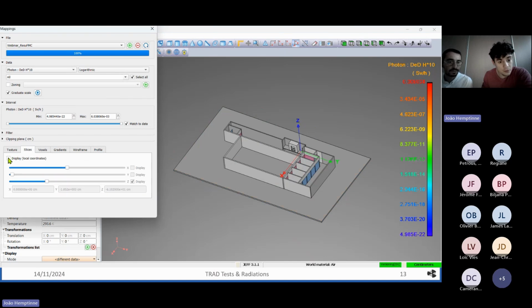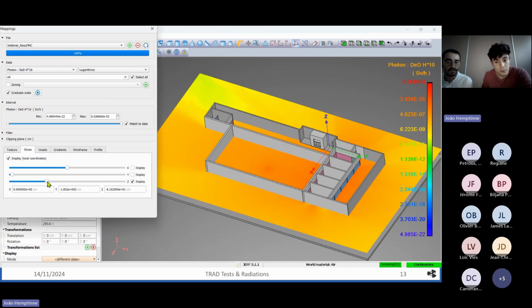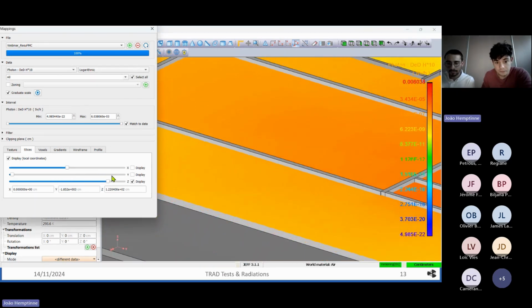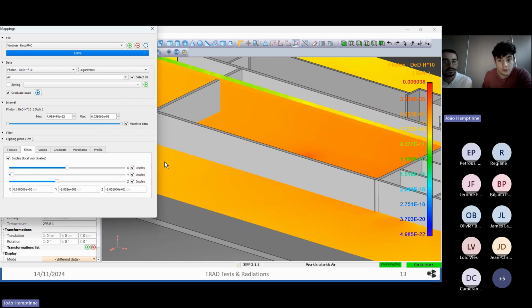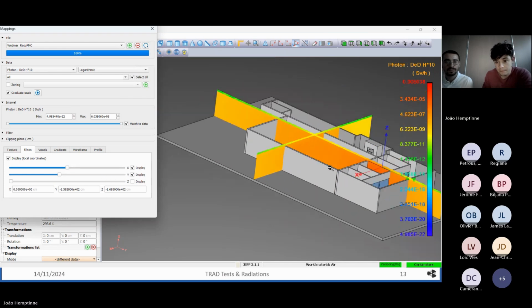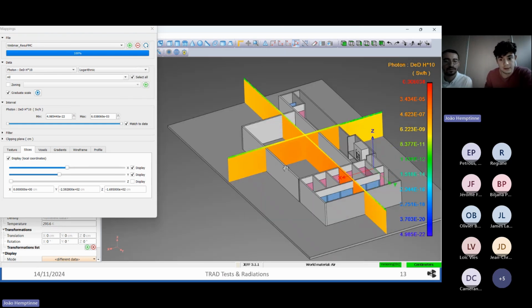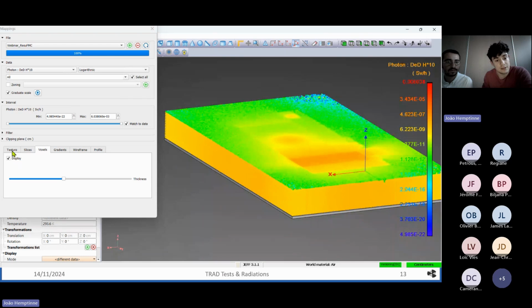But if you want to know your dose distribution at different slices, if you want a slice view, you can also do that. For example, following the z-axis, you can choose the height of your slice, and you can do it following the two other axes as well. For example, here following y, and here following x. So if you want to focus the analysis on a part of a model, you can easily use this kind of visualization. The voxel mode is pretty much the same thing as the texture mode we just did before. It's in order to have a global view of the model.